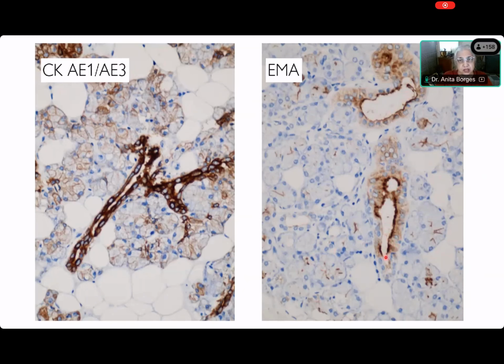And the myoepithelial cells are not the second layer of cells that you see in this picture on the left, because you don't get myoepithelial cells in what is called the striated duct. This big duct that you're seeing over here is the striated duct. And in the striated duct, the cells that form the second layer, that means the abluminal cells, away from the lumen, are basal cells. They're not myoepithelial cells. And I think there is a big difference between basal cells and myoepithelial cells.